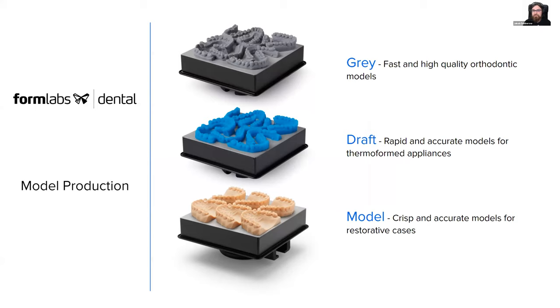Some are also using the dental model. These are just general standard resins, which are basically in different shades right here. So it's basically your choice which one you prefer. But you can also feel free to use the draft resin, which was first off made for 3D printing very, very fast. So this can also be a thing to speed up your whole process.